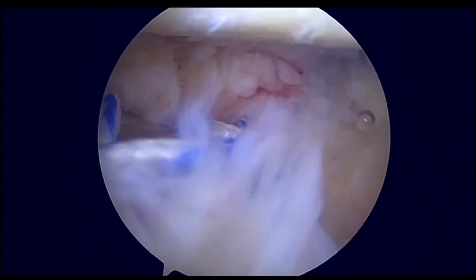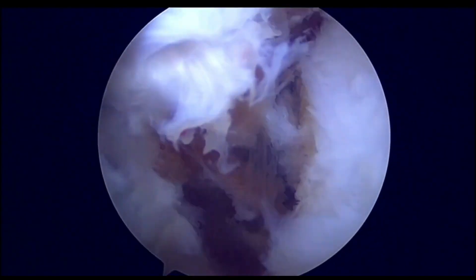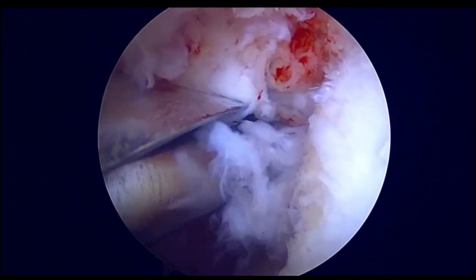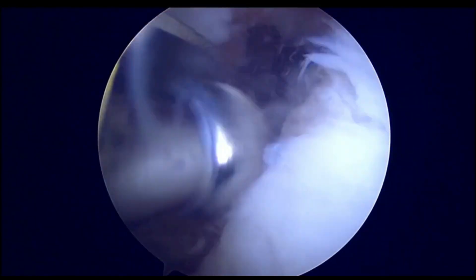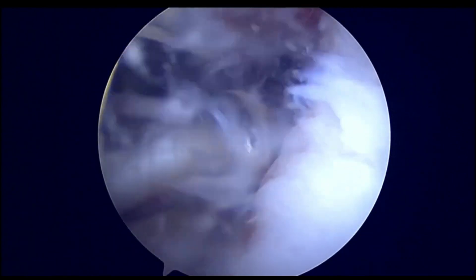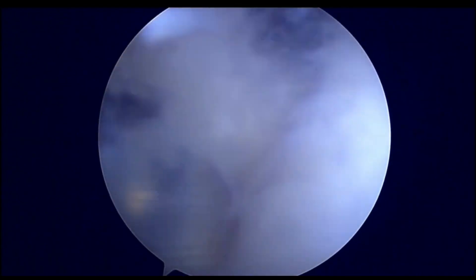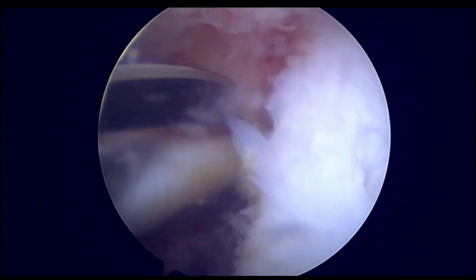Here we are performing a distal clavicle bone block procedure to treat this problem. What we are trying to do is elevate the labrum, and then we will be preparing the glenoid neck. The glenoid neck is prepared so that the bone block can be placed on the anterior aspect of the glenoid neck, and there will be a good bony union between the bone block and the glenoid neck.